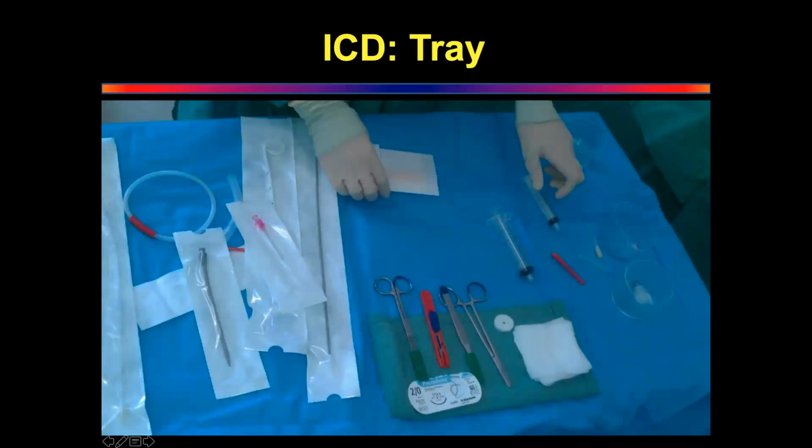Describe to me how you do a Seldinger technique. Sir, should I start with consent? No, just come to the technique because today is a lecture. So first we will do the positioning. The patient is in a sitting position with his arms supported by a stool to keep them flexed and abducted.